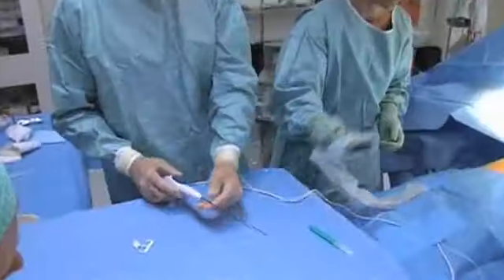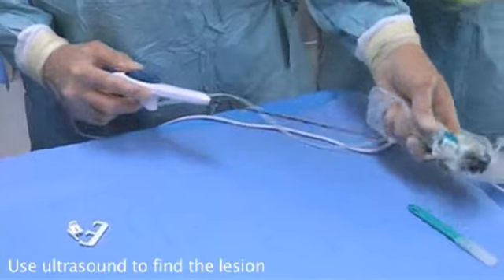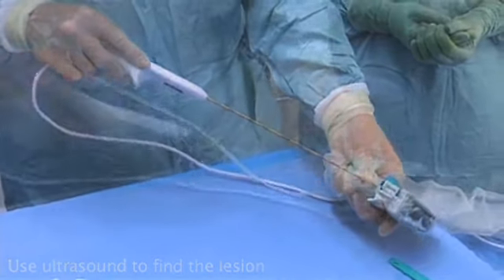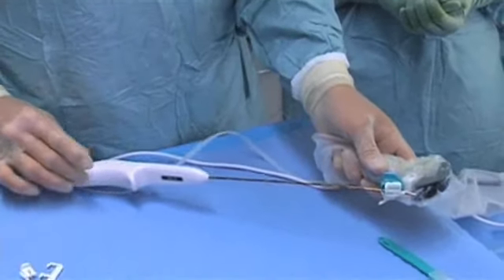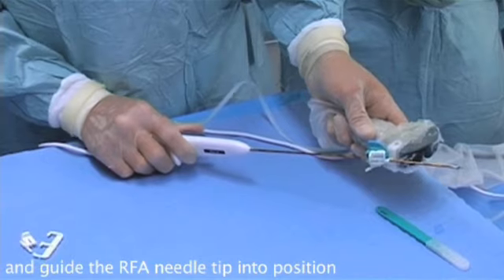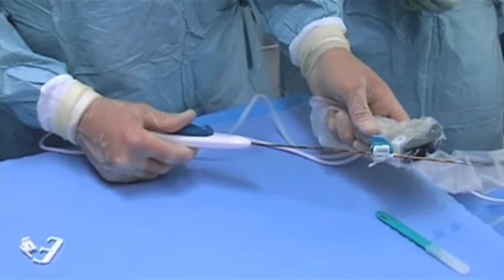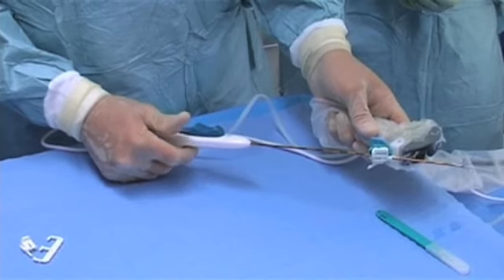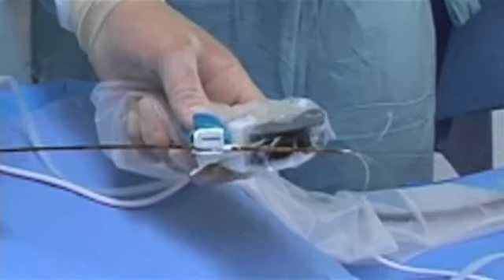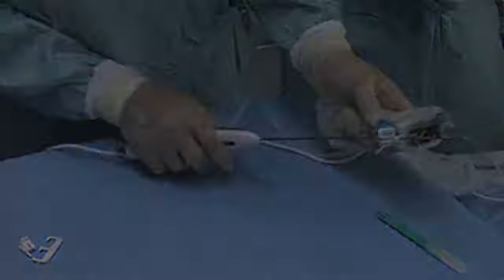The technique is now that, ultrasound-guided, we are actually finding the lesion, and when we have found the lesion through a small incision in the skin, then we can guide our needle into position, open it to 2 centimeters first, heat a little bit, go to 3, go to 4, go to 5, and then heating step by step until we have reached 7 centimeters if we desire to do a 7 centimeter lesion.